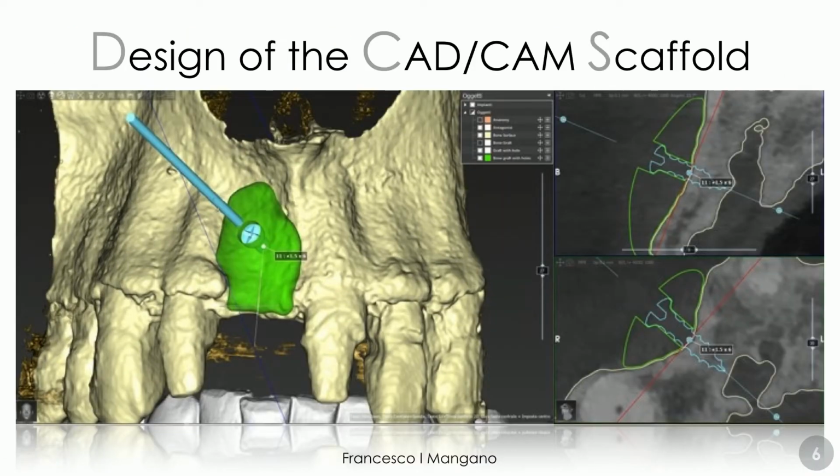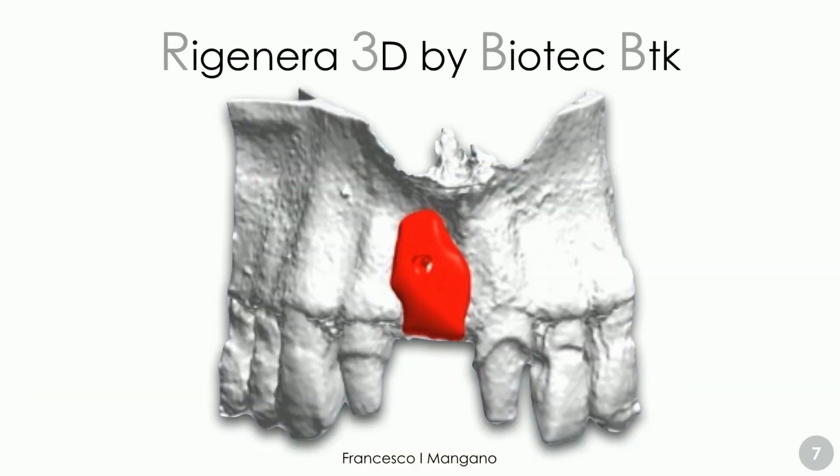We can prepare the hole for the fixation screw, we can study how to make it better. We can basically control everything, also thanks to modern software like ReLU or DentalCAD with artificial intelligence. This software helps us to superimpose all data automatically and, most of all, to segment the bone automatically. It works very well.